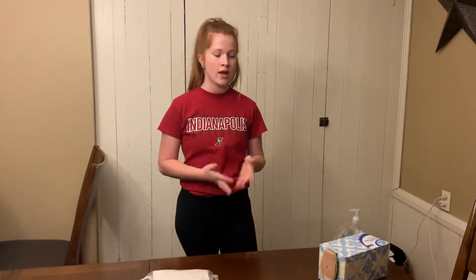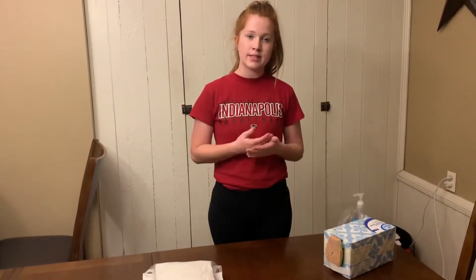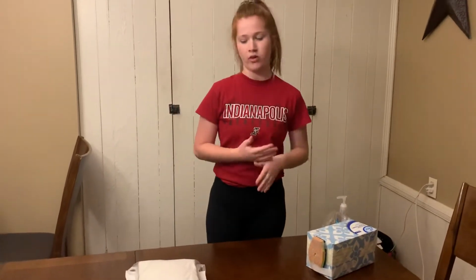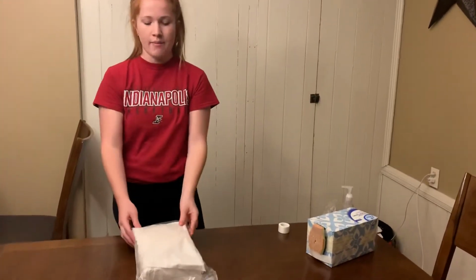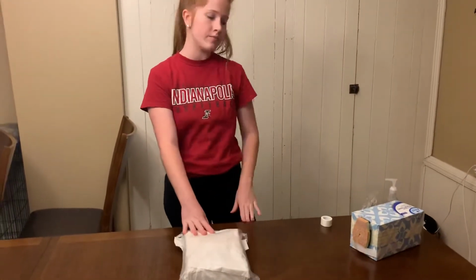And then I also verify my physician's orders that this patient needs a catheter, what size catheter to use, and things of that sort. I would also assess the patient's last time they voided or the last time they were catheterized. Next, I'm just going to make sure I have all of my supplies. I have my hand hygiene, my tape, and then my sterile catheterization kit that has my gloves and everything else that I need.